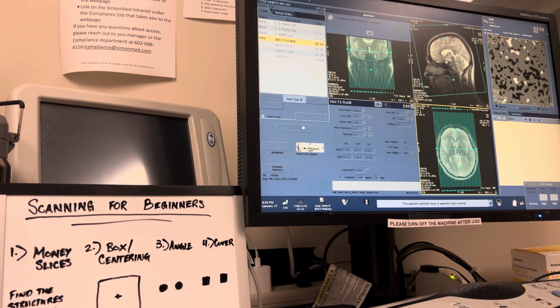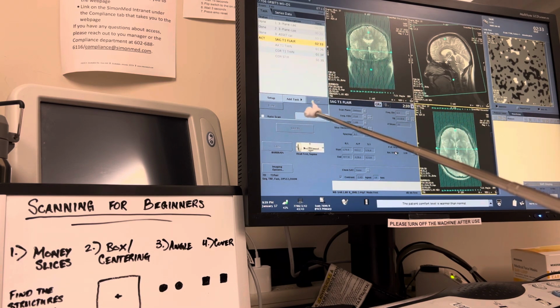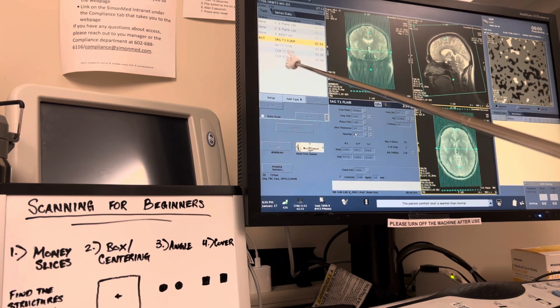Now let's click OK. For some reason it says we need to input contrast, even though it's already input, and it's a without sequence or protocol, without protocol. So not quite sure. We probably should have unchecked that earlier, but that's okay. Let's click scan. Now let's go into the axial T1 thin. So this was a full brain sequence. So now we're going to get into the, I'm sorry, not the IACs, the orbits.